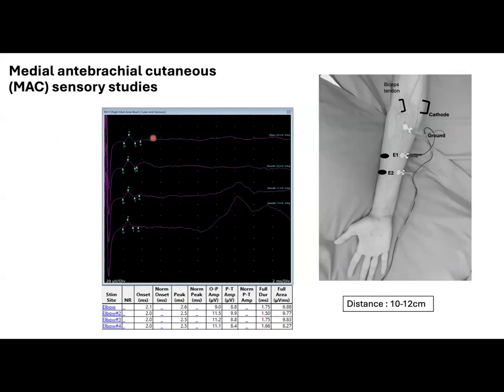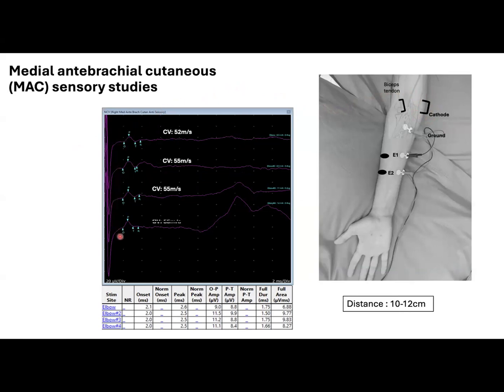Motor artifacts are less common with the medial antibrachial cutaneous nerve, as we can see here when we stimulate at the midpoint between the bicep tendon and the medial epicondyle. This nerve is usually very superficial, and supramaximal stimulation can be achieved with low intensities. As we increase the stimuli, there were no significant changes in amplitudes, but a motor artifact is gradually appearing. As a last remark, to maximize the SNAP amplitudes in MAC or LAC studies, the recording electrodes may have to be repositioned either slightly medially or laterally to the original position.